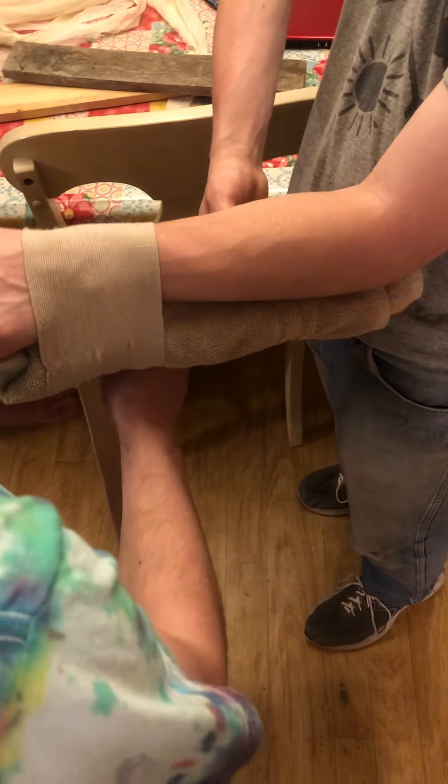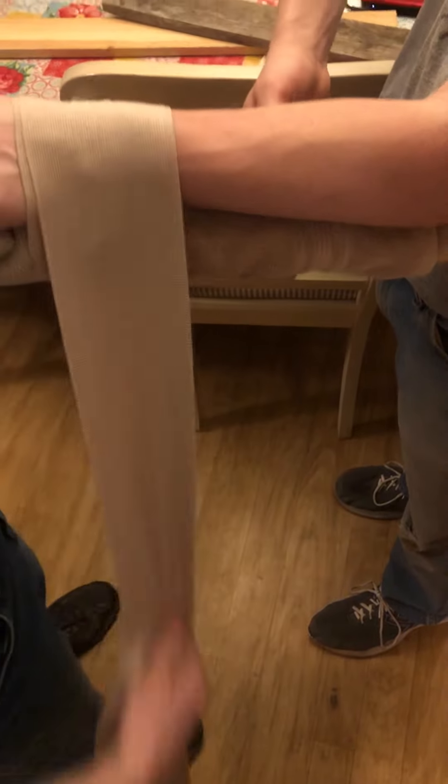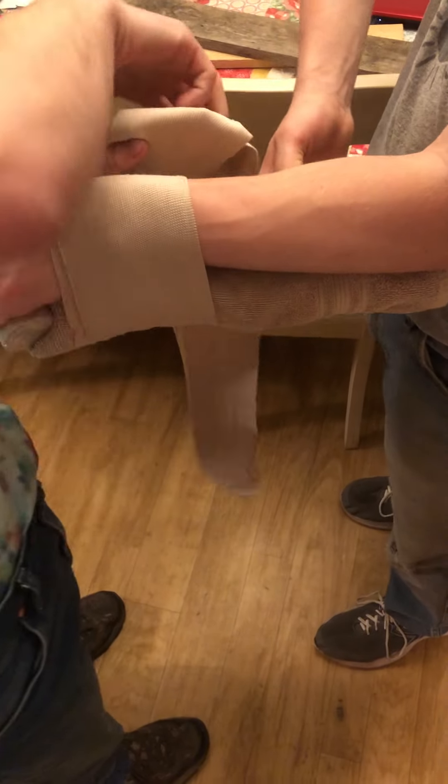So first you will start at the wrist, you will hold it tight, you will wrap approximately twice around. And then you can start wrapping it up the forearm.